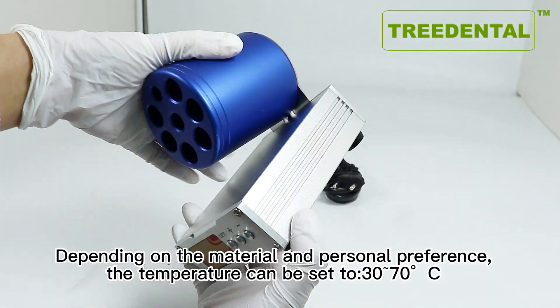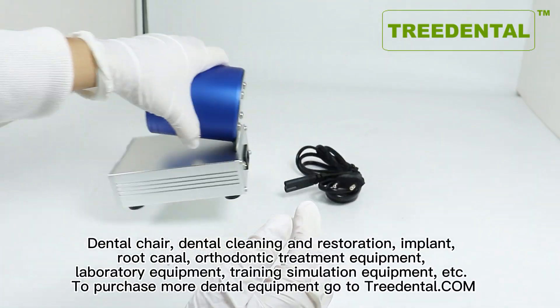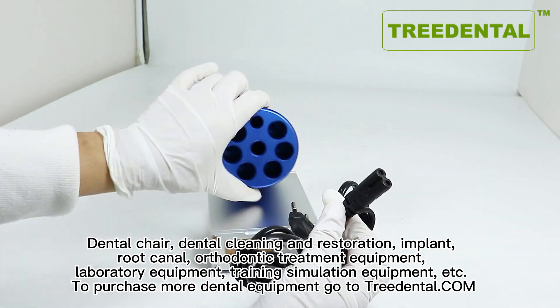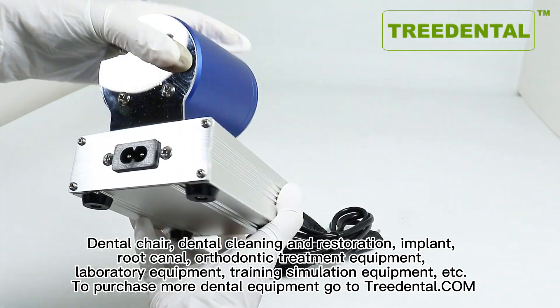Depending on the material and personal preference, the temperature can be set to 30 to 70 degrees. Compatible with dental chair, dental cleaning and restoration, implant, root canal, orthodontic treatment equipment, laboratory equipment, training simulation equipment, and more.